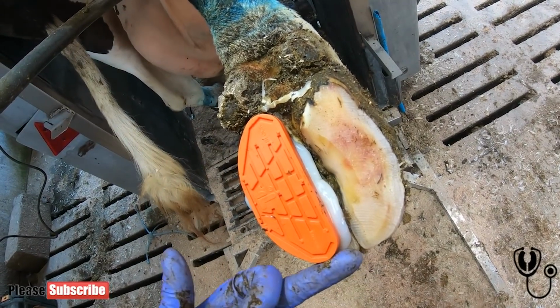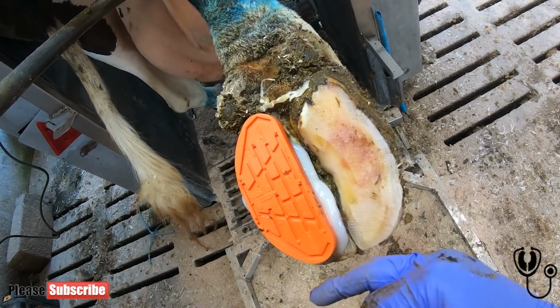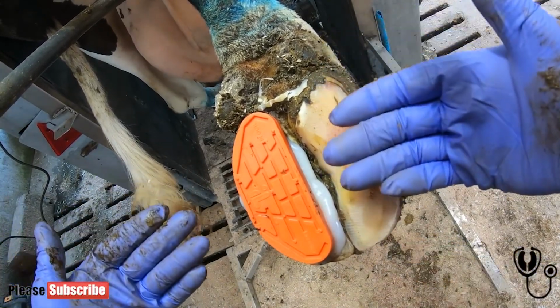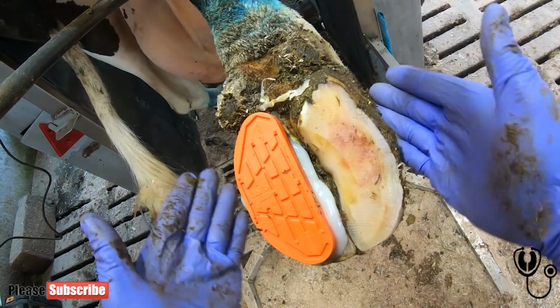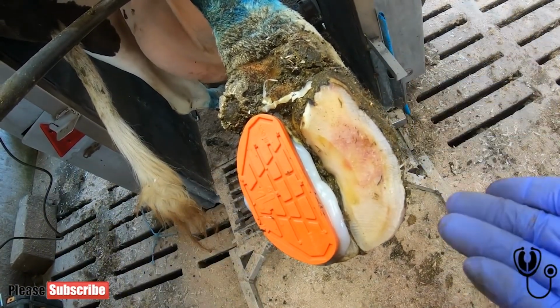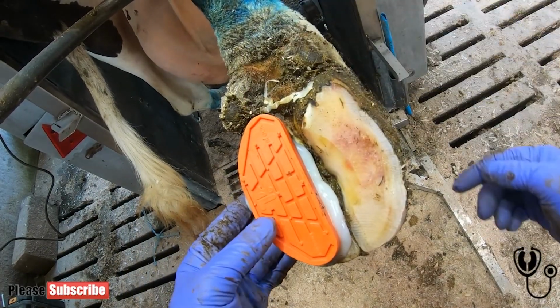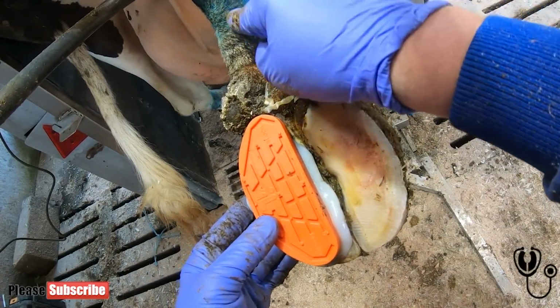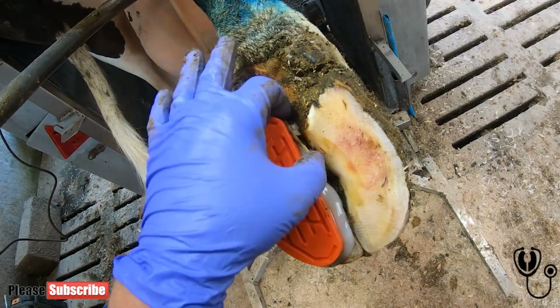Now you'll see I've actually set this slightly further back than the toe, because if you put it close to the toe, she won't get as much use out of it. By the time her foot grows this way, the block will be in the wrong position and she'll start walking back on the heel, which would extend this flexor tendon that comes right the way down here, and she wouldn't be comfortable at all.